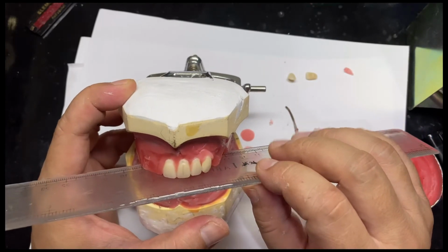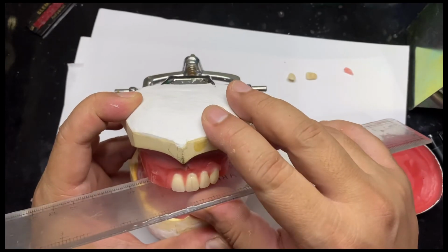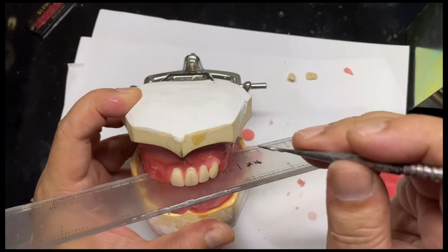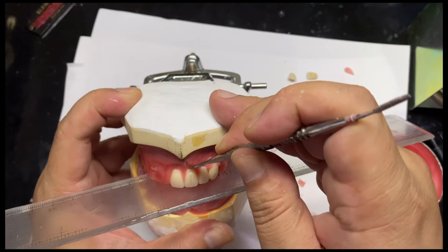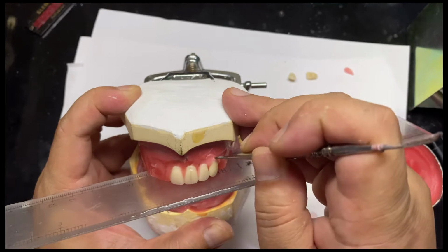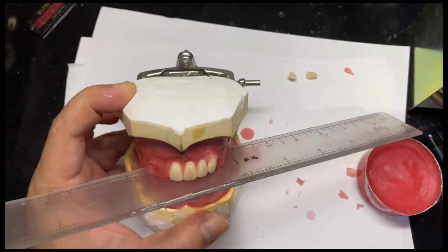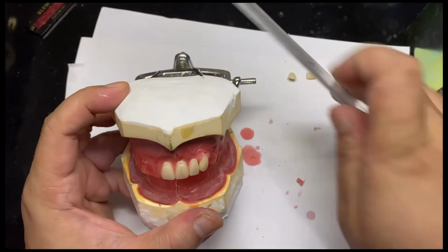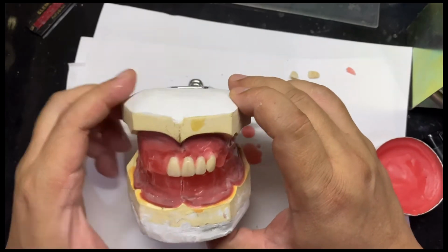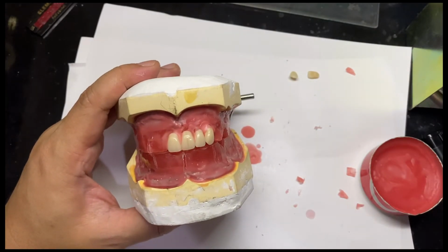If all the incisal edges and tips of the central and lateral are in contact on this plane, good. Now if you need to adjust, you just simply push a little distally, incisally. Now I'm going to set the other side before I start setting the lower anterior.